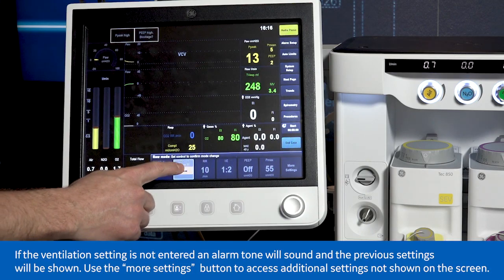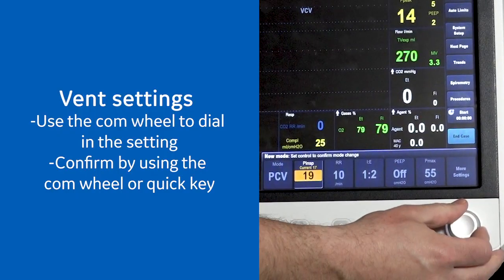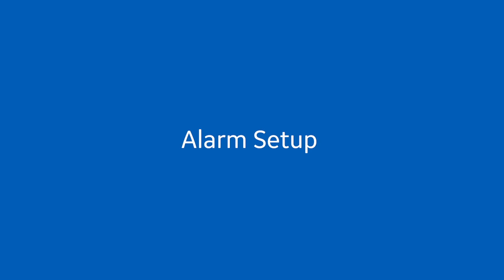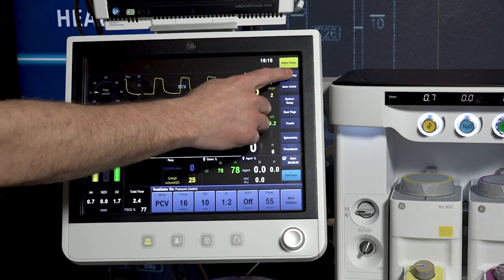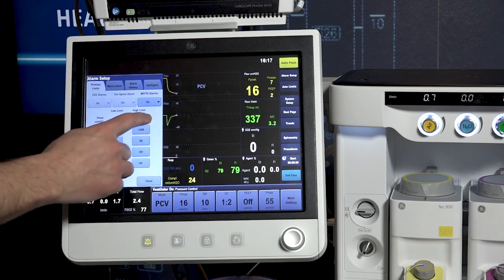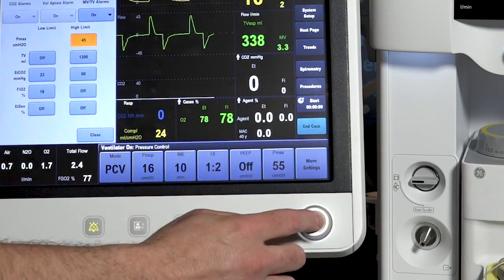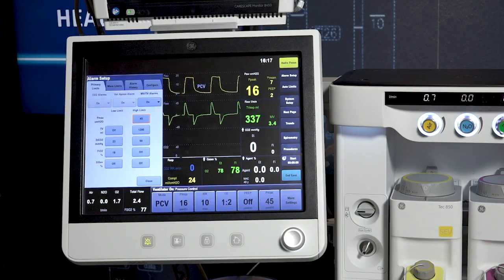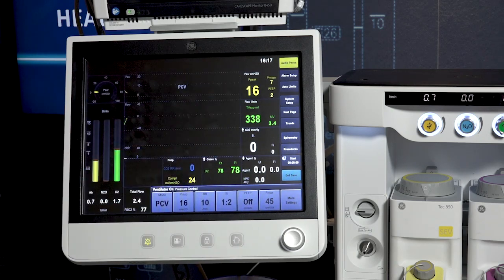To change the vent settings, select the ventilator quick key for the desired parameter to change. Use the comm wheel to dial in the setting and confirm by using the comm wheel or the quick key. Select audio pause for a two-minute audio pause. To adjust your alarms, select alarm setup. From the primary limits and/or more limits tab, select the alarm limit to adjust and make the change. Press the comm wheel in to confirm. To close the menu, press the home key, touch the waveform area of the display, or select close.